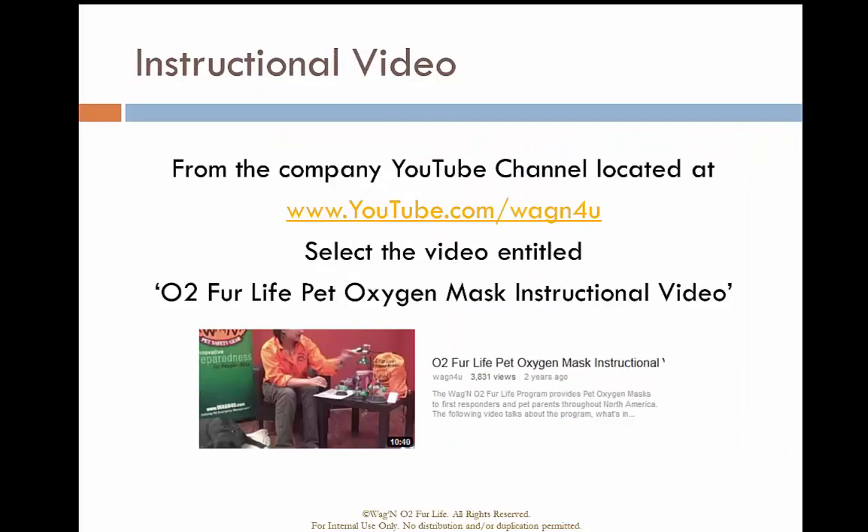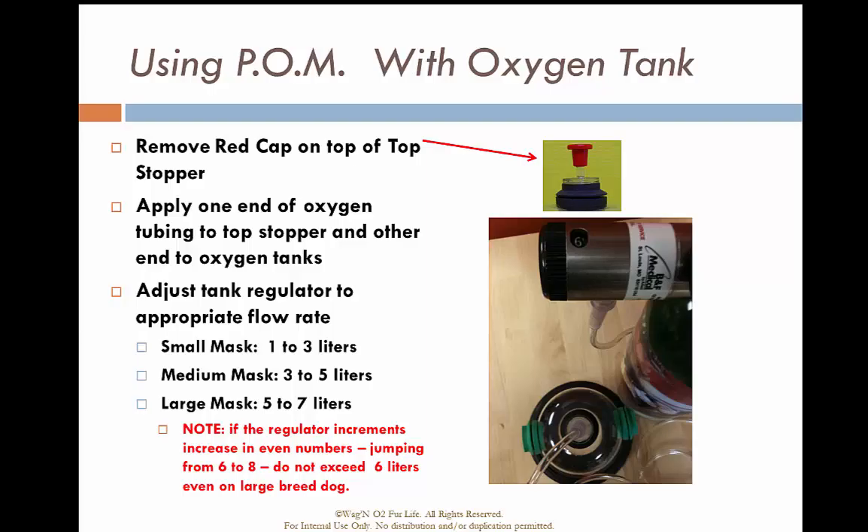If you want more detailed information than what's provided here today, please go to the O2 Fur Life Pet Oxygen Mask Instructional Video website. The mask is fairly simple to use: remove the red cap, attach the oxygen tubing to the mask, and then connect the other end directly to the oxygen cylinder.